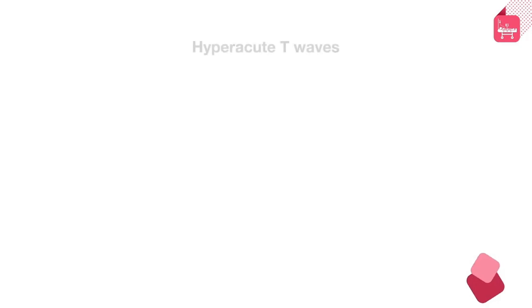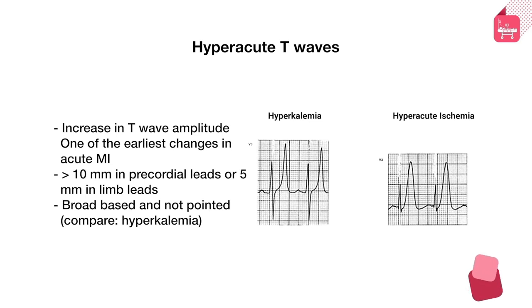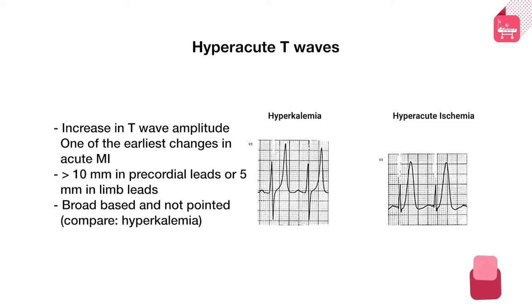Another important T wave finding is hyperacute T waves — where the upright T wave amplitude is exaggerated. This is one of the earliest changes in acute myocardial infarction. While most people are attuned to pick up ST elevation, hyperacute T waves are sometimes missed with potentially disastrous consequences. The T wave in hyperacute ischemia is increased in amplitude and is generally broad-based, not pointed — contrasting with hyperkalemia, where T waves are narrow-based, tall, and tented.